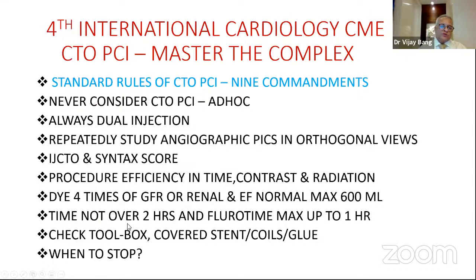And toolbox, of course, we must all check according to our strategy, whether all the hardware is available or not. In addition, we should look at the availability of covered stents, coils, and glue if required.